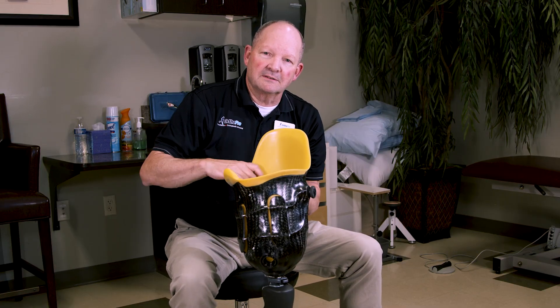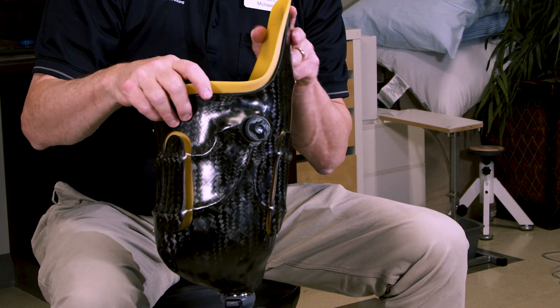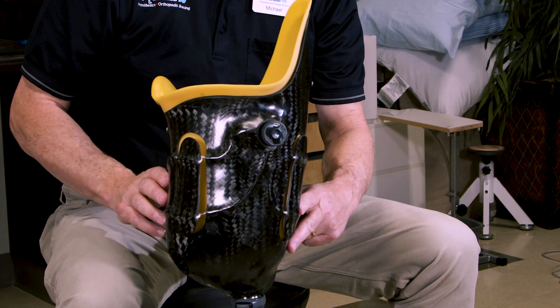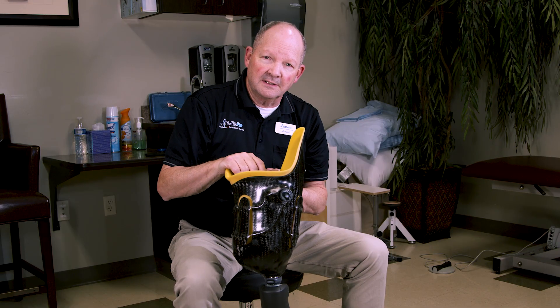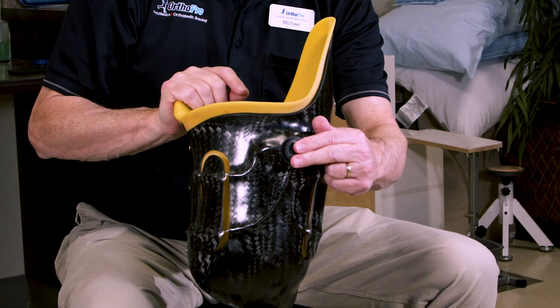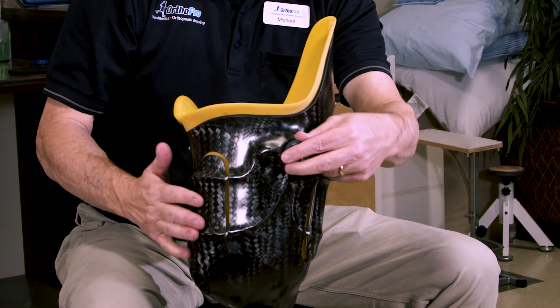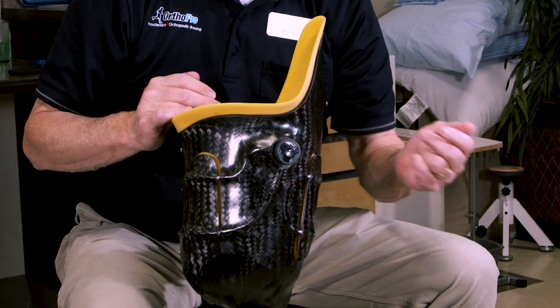The other feature of this particular socket is this dial here, which is referred to as either a Boa dial or a Click Medical dial. You'll notice these panels on the side — it makes this socket adjustable. So if we have some fluctuations in the fit of the socket, all the patient has to do is once they put the socket on, they push the button and then dial it in so that it squeezes these panels together for a more intimate fit if necessary.